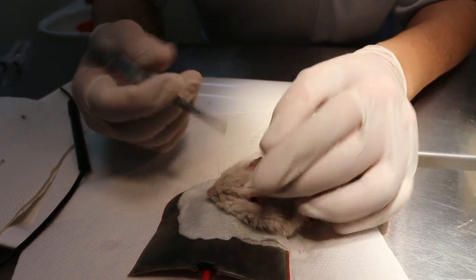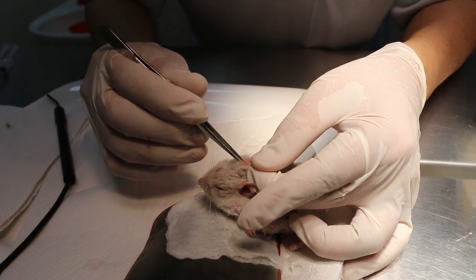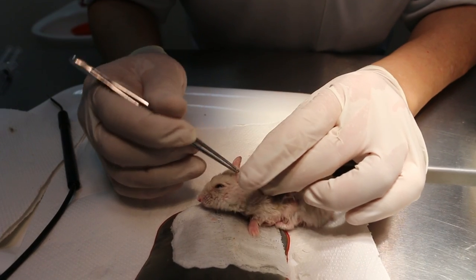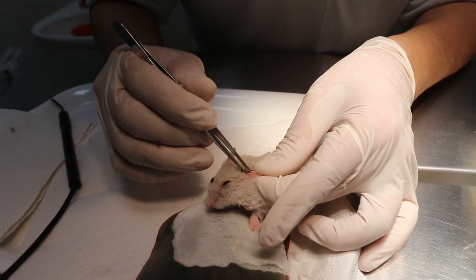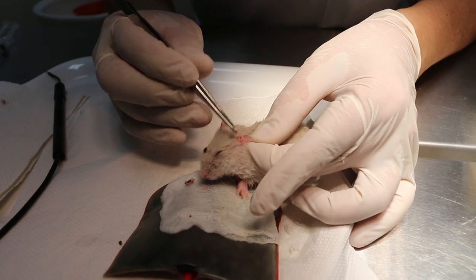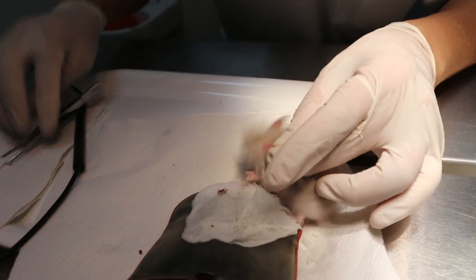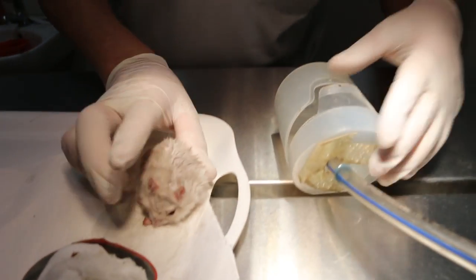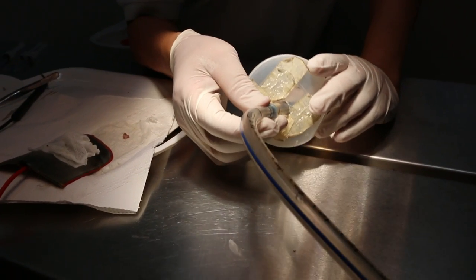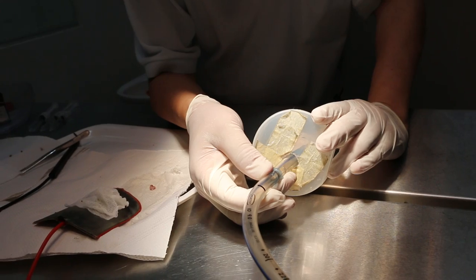This hamster also has dirt in the ears. Ear drops would do, you know. Actually, it is probably another wart. Could be dirt in the ears, and there's some pus. Now he has woken up, so anaesthesia again. This one could use Zoletil injection, but he's so fat, so it's better not to. 1, 2, 3, 4, 5, 6, 7, 8, 9, 10.